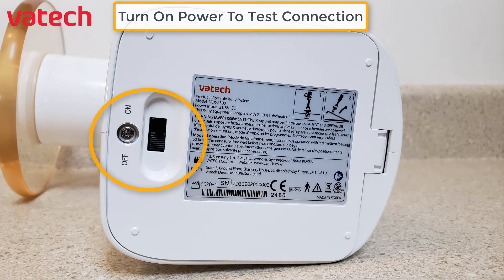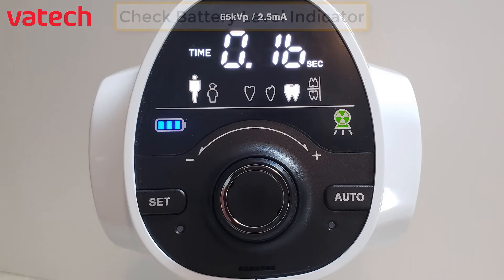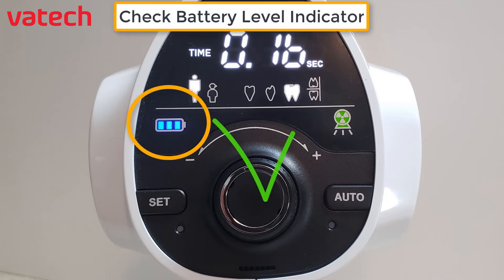To test, turn the power on from off to on. Check the battery indicator light and you're ready to capture images.